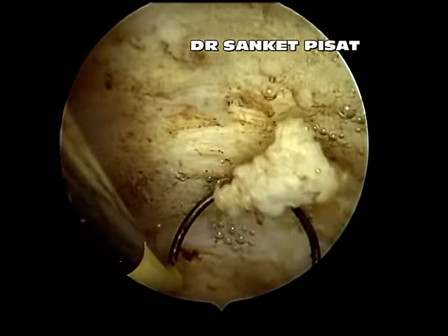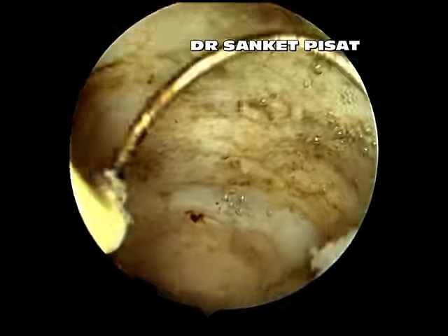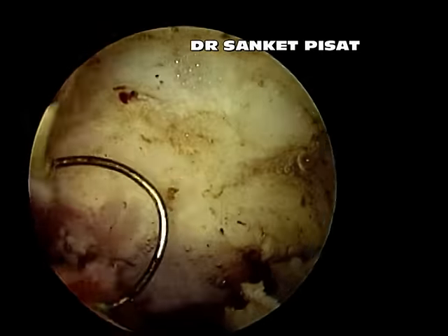As you can see, most of the fibroid bits have been removed. The last bit of the fibroid has now been excised.